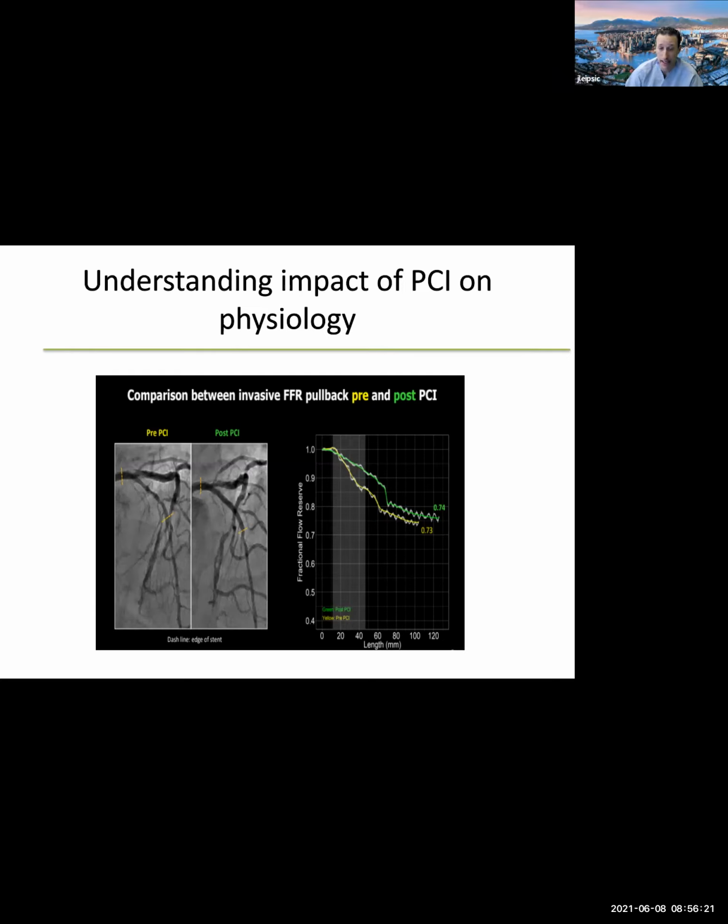And I do think advanced analytics, as we see from your team on the MR side and certainly on the CT side, whether it's plaque or some of this volume to mass, will be really important in helping us understand why some women have angina despite a lack of anatomical target. I think this coronary volume to mass may be a very important measure. And then I think the physiology is important in refining our understanding of who's going to derive benefit from revascularization.